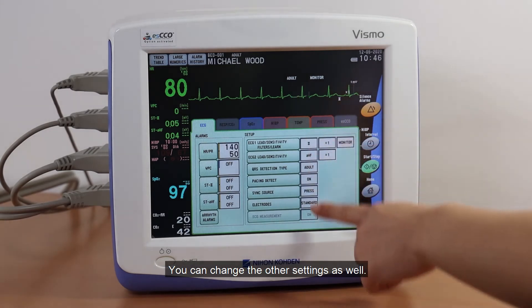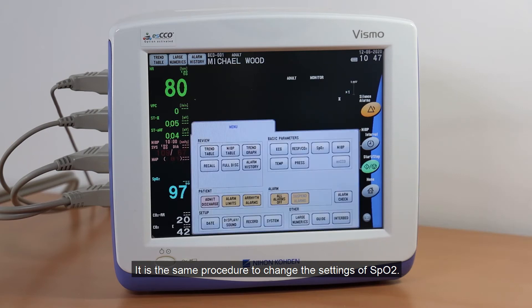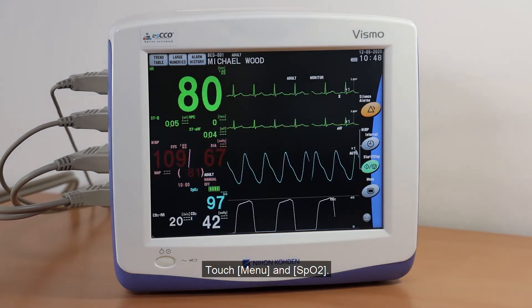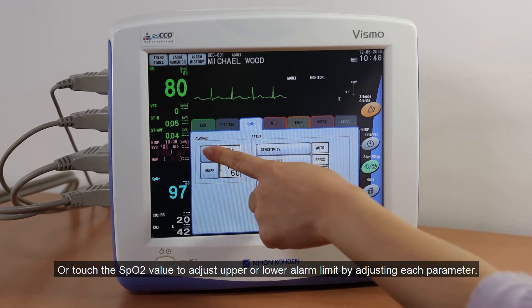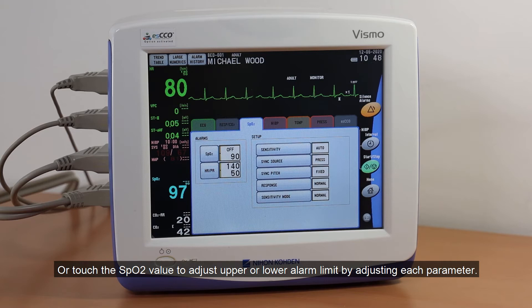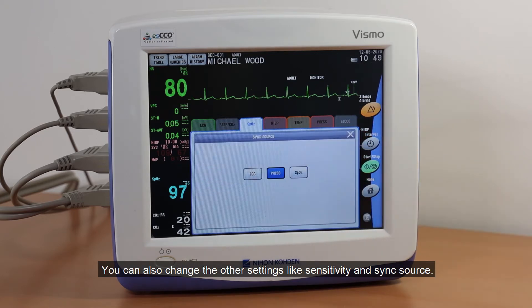You can change the other settings as well. It is the same procedure to change the settings of SpO2. Touch Menu and SpO2, or touch the SpO2 value to adjust the upper or lower alarm limit by adjusting each parameter. You can also change other settings like Sensitivity and Sync Source.